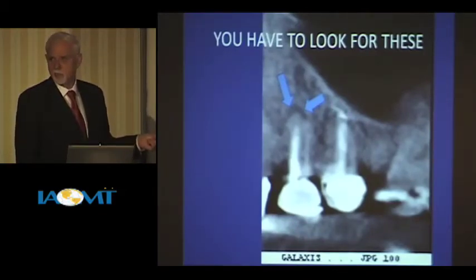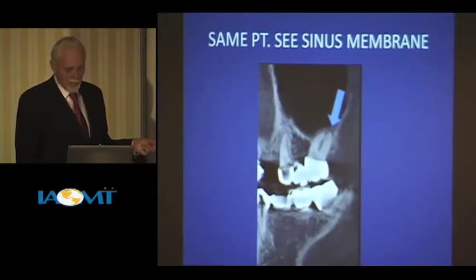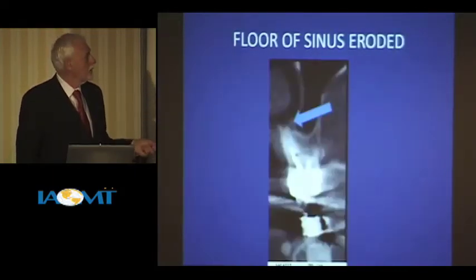Did I just lose the mic? No? We're all right. All right, same patient. Look at the sinus membrane, small lesion, and look at this. There's some reaction to that. Floor of the sinus here is eroded.